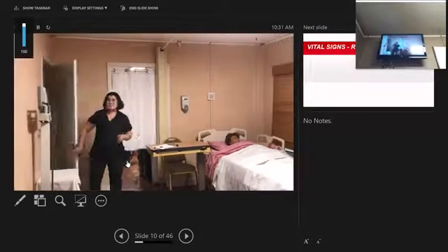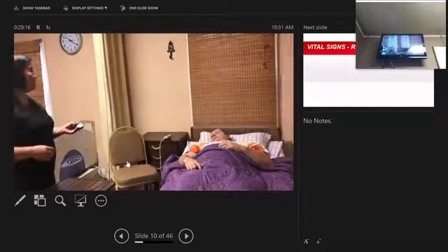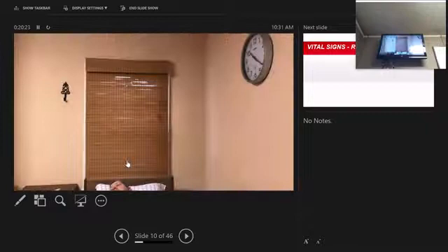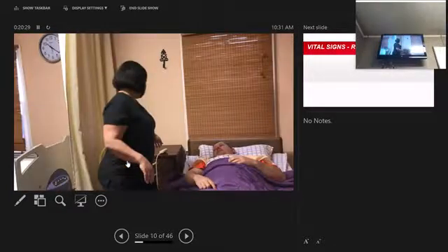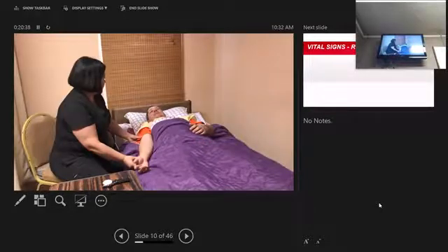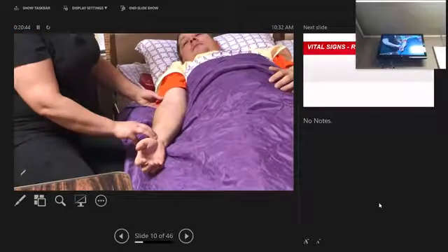Come in. Hello, Mr. Mills. My name is Tanya. I'm going to be your CNA today. It's time to get some vital signs. We're going to start with counting your radial pulse. For this, we're going to need a watch or the clock on the wall with the second hand. I need to wash my hands, practice the courtesy, and get your bed to a comfortable position for myself.